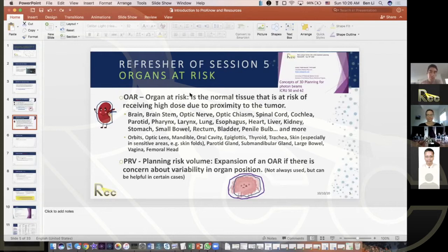So Dr. Beestoon, I'll get more into this later on in the lecture. To answer your question quickly though, where you see gross disease, where you might see a really bulky involved lymph node, you'd want to contour that also as part of the GTV. And then you'd want to include some sort of expansion around that to account for the microscopic disease that could be present in the vicinity.